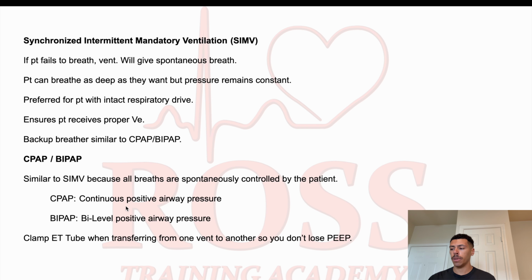It's just a tube that's going to be plugged into the oxygen tree, and then you have a mask that you strap tightly to the patient's face. And now you can do CPAP and provide that continuous pressure to the patient. You don't need any real fancy equipment for CPAP itself, but for BiPAP, for what's preferred, you are going to need a ventilator to provide the BiPAP to the patient.